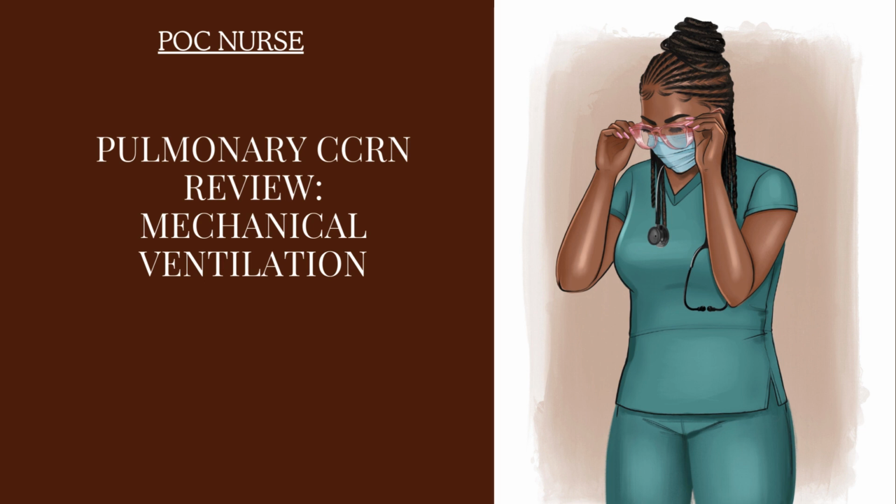So for example, if you're just trying to wean the patient off the ventilator and this is their first, second try at CPAP, they may get tired after some time of being on CPAP. So that's it with CPAP.